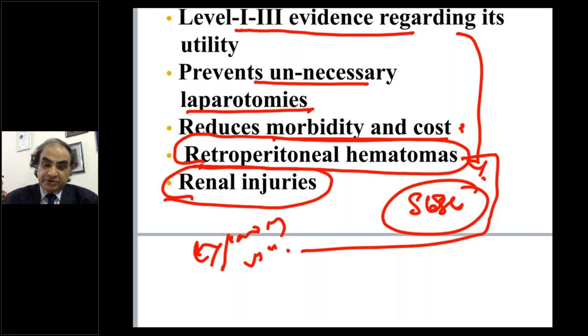How would you see a retroperitoneal structure in an intraperitoneal approach through a laparoscope? A challenge. Then you can approach it the other way, through the retroperitoneal space, which is done. Or you have indirect evidence. Or you can exclude other injuries. Isolated renal injuries are not so common. Isolated renal injuries would be extremely rare.